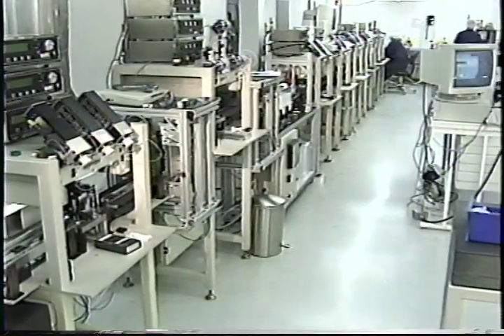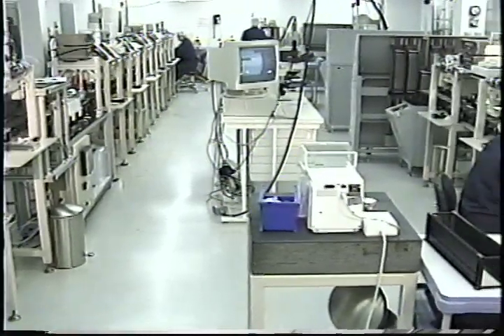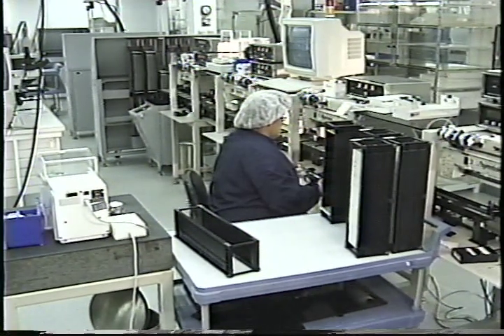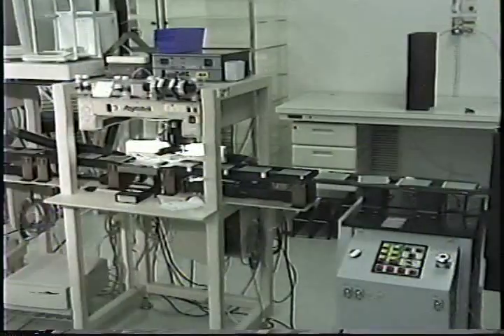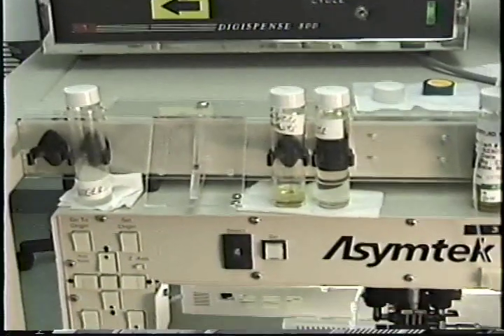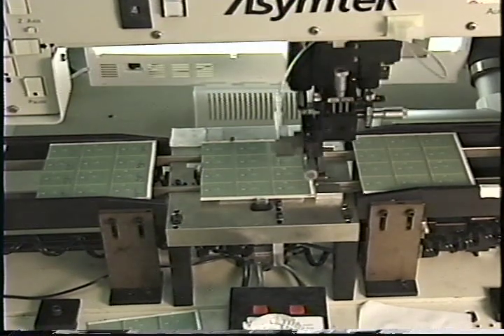The 12-up panels are then passed through to the next process. All manufacturing at Diametrics is performed in a clean room environment to ensure quality and high yields. Our clean rooms range from class 1,000 to 100,000. It is in the sensor area that the sensors are dispensed onto the chips. The composition of the sensor solution ultimately determines what tests the chip can perform.